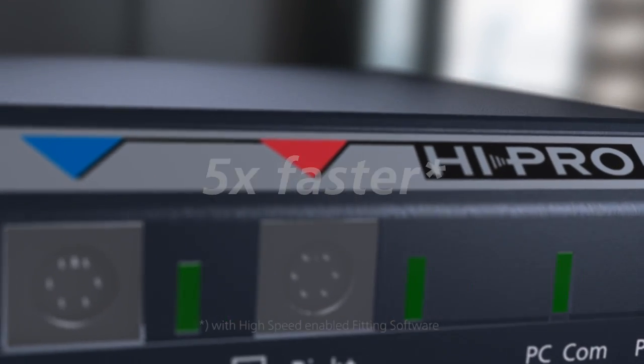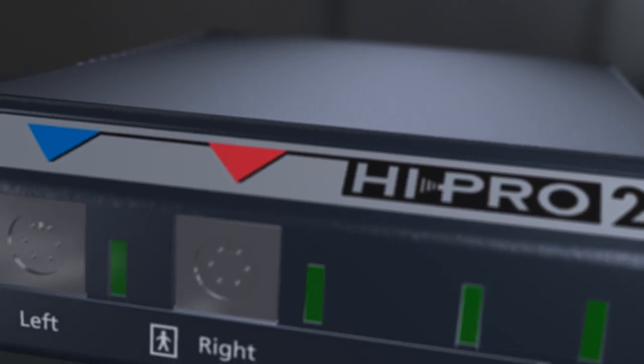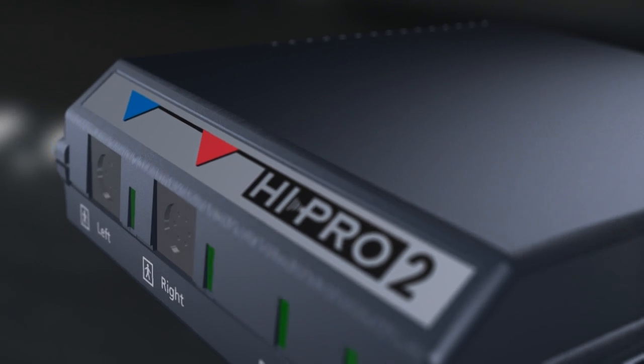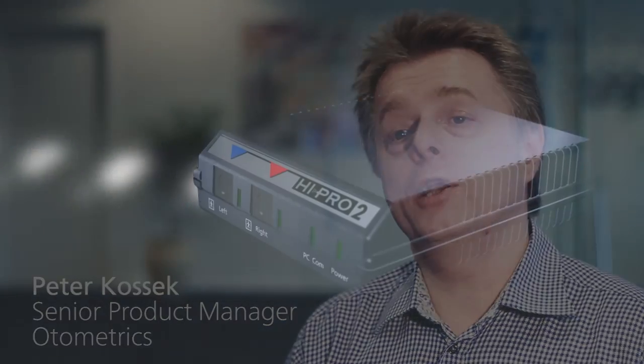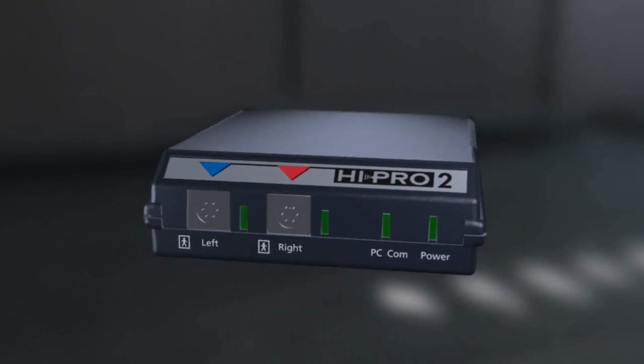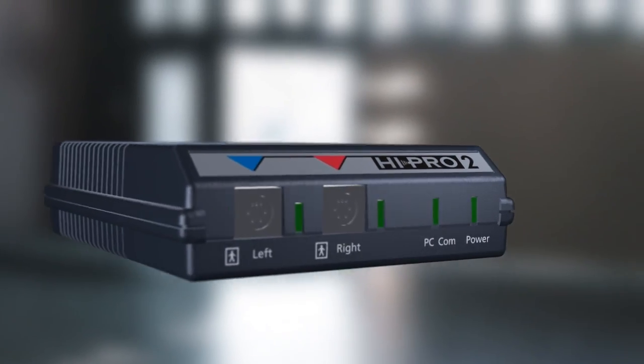The process will be perceived as more efficient and more professional. Hypro 2 is backwards compatible with all previous versions of Hypro. Therefore you can switch to using Hypro 2 for all Hypro compatible hearing instruments right away, and be prepared to benefit from the speed increase as fitting modules implement the high-speed mode.